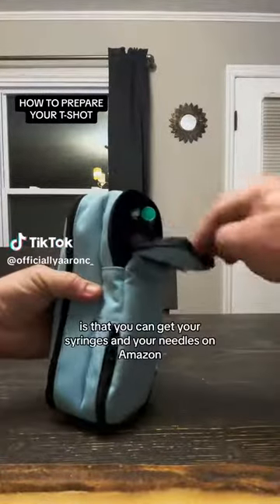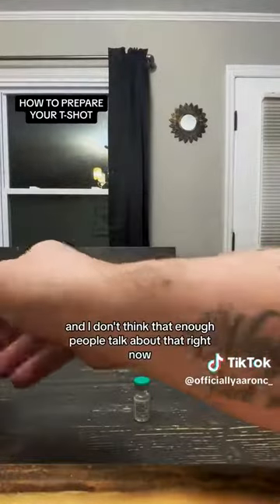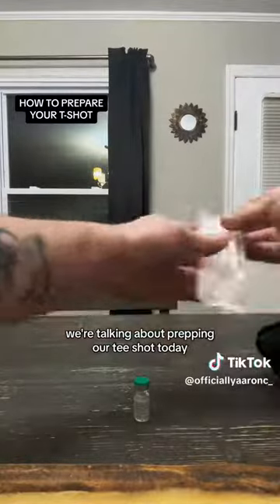Potentially the biggest hack ever is that you can get your syringes and your needles on Amazon, and I don't think that enough people talk about that, so I want to make sure to lead off with that. We're talking about prepping our testosterone shot today.